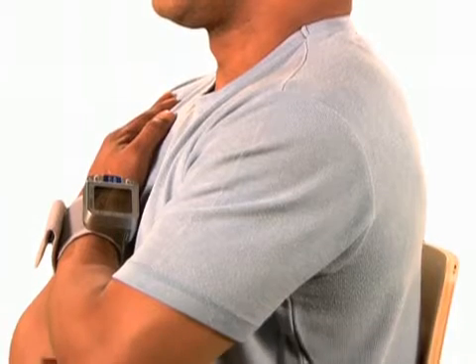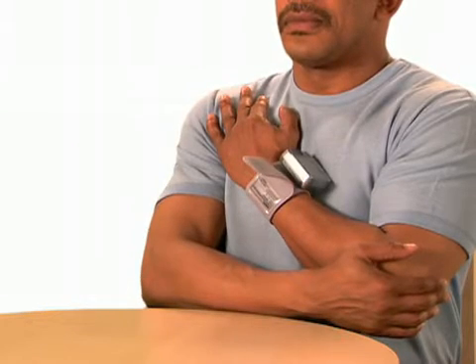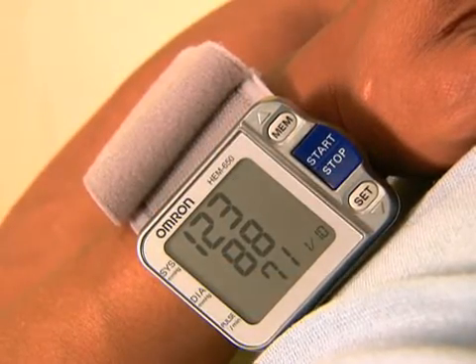Sit straight and do not move during the measurement. The cuff will begin to inflate when the correct position is reached. Hold still until the cuff deflates and your results are displayed.